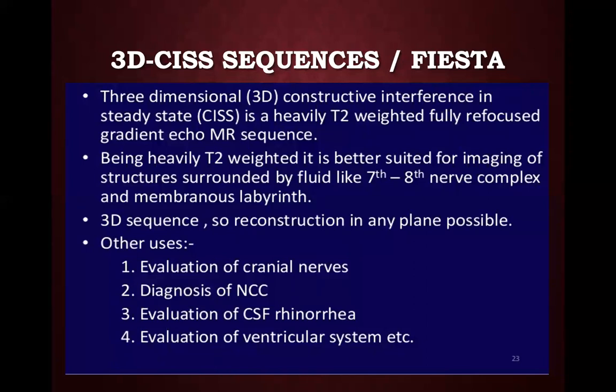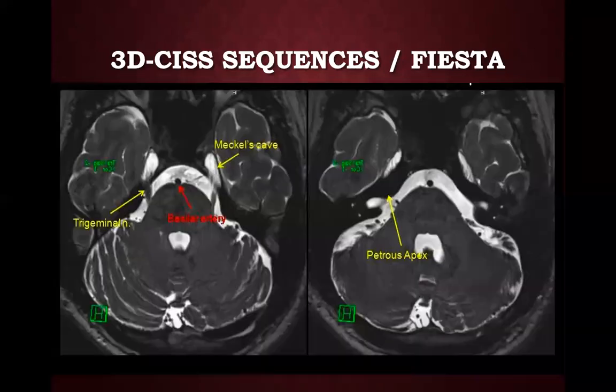When you enhance the signal coming from a single tissue, it is called gradient echo, and it's a heavily T2 weighted image. Now, this is important because we need to see what is happening inside the CSF, in the cisternal portions of the brain.